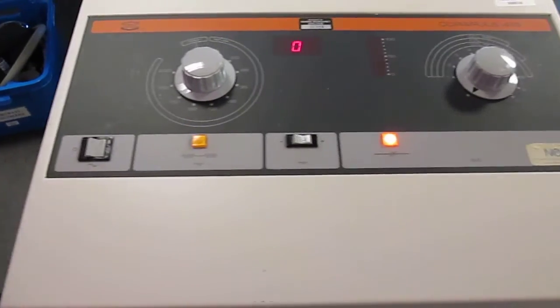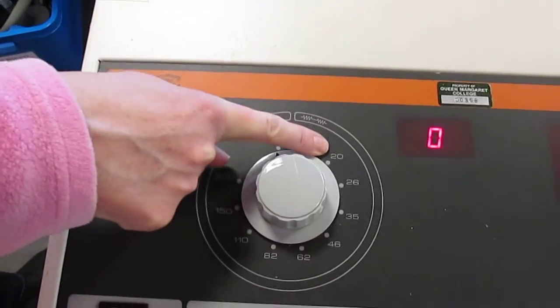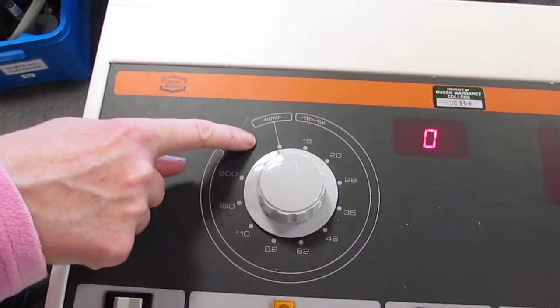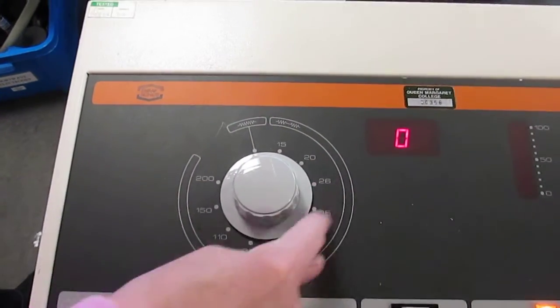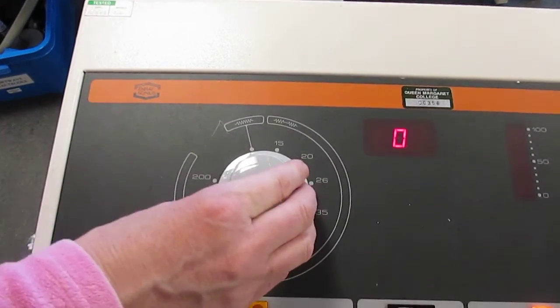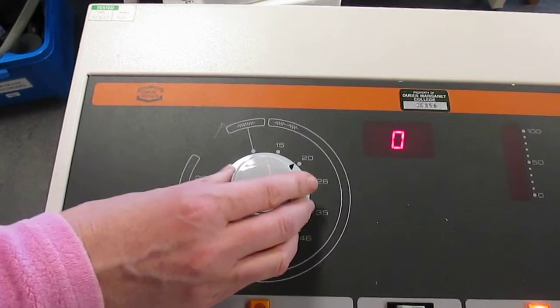You then want to choose whether you're going to use continuous mode or pulsed. This is known as the pulse repetition rate, these numbers here. This dial is pointing to continuous, but I can change it to pulsed and choose my rate by turning the dial clockwise.